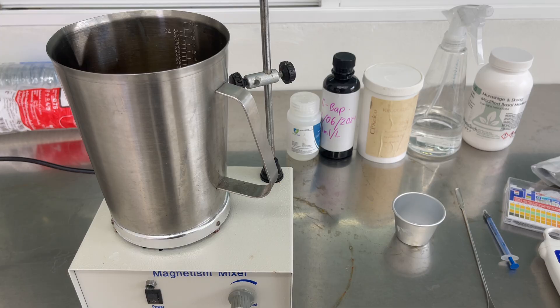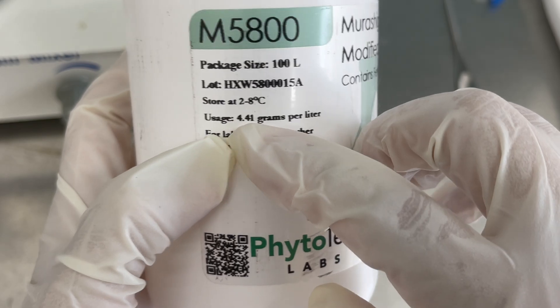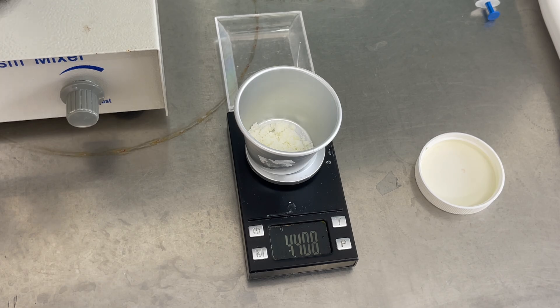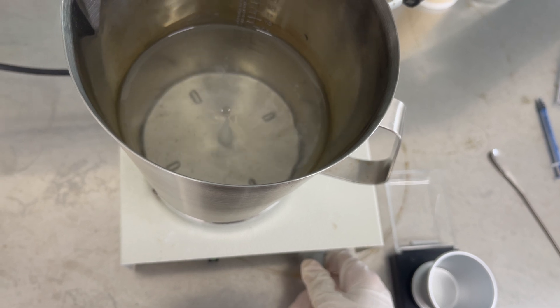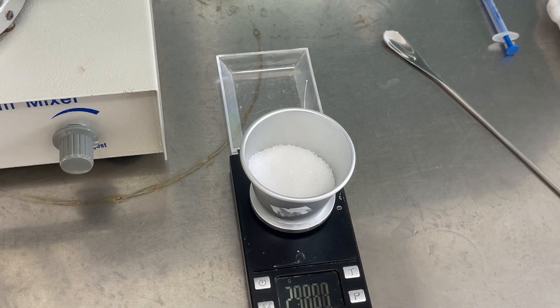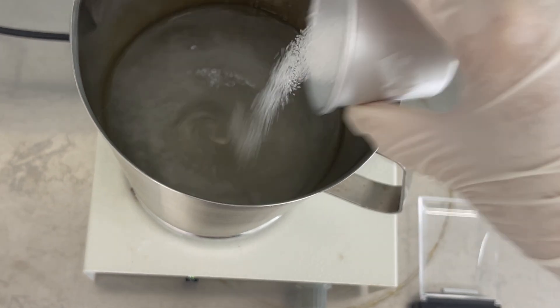Now that we're done with the ingredients, let's prepare our media. Using a digital scale, I weighed 4.41 grams of MS media as specified on the bottle, then added it to the prepared distilled water, stirring gently. Do not heat the solution before adding the gelling agents because it can cause clumping. Next, I weighed 30 grams of sugar and slowly added it in while stirring, since it's going to be hard dissolving the sugar without heat.